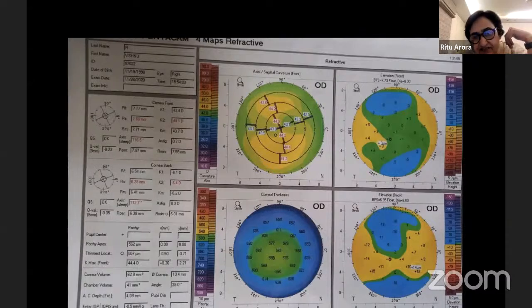So if you get a value which is say 1 or 2, you're dealing with an oblate cornea. Sometimes we are at a loss to know whether the Pentacam I'm dealing with is a post-ablated cornea or not. But in post-ablation also, it only picks up if you have ablated more than 3 diopters. And if it is more than -1, more on the minus side, what does that mean? An ectatic... Hyperprolate cornea.